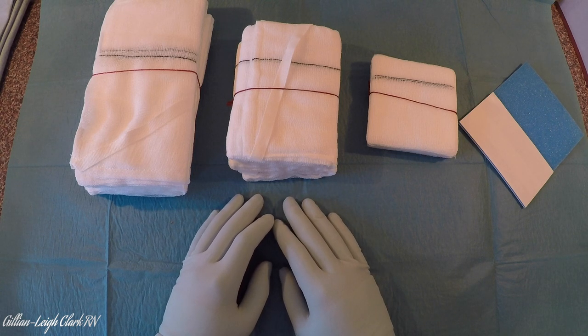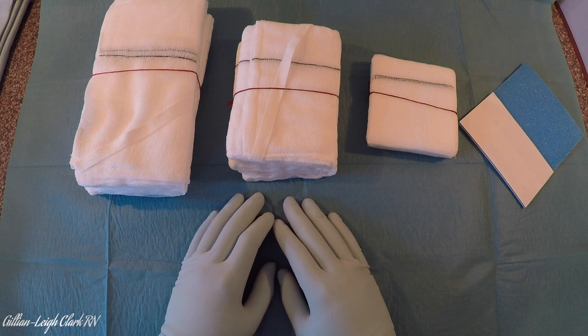If swabs go into a patient, or are staying in for a short time, they must be documented on some kind of swab board or paperwork. There are lots of things we're looking for in these, and I'm going to try and explain a little bit.